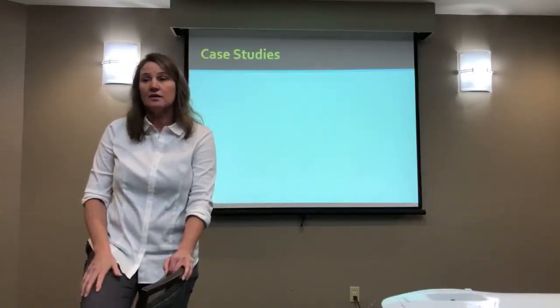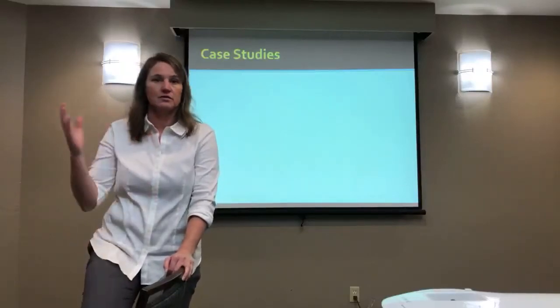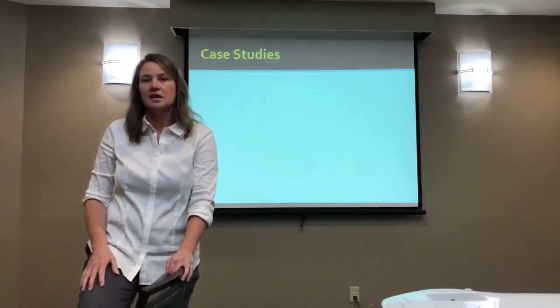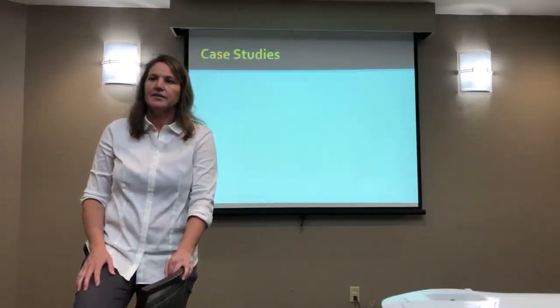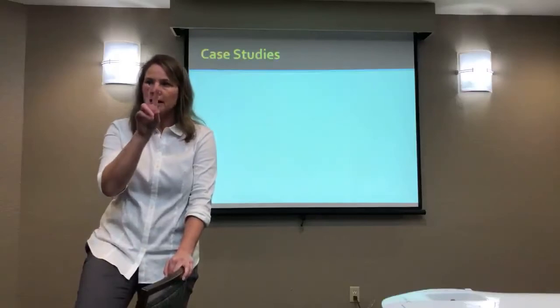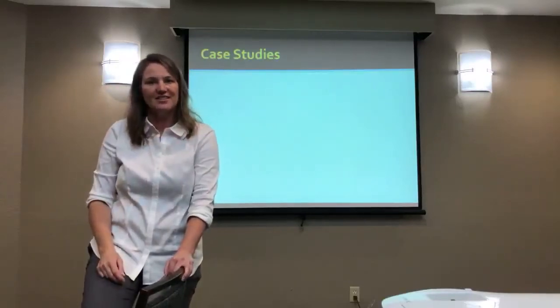I agree. Try that, to get a good feeling. It's repeatable. I mean, it's like our controlled studies that we use, the Berg and the functional gait assessment. All those tests: inter-rater reliability, repeatability. Can you do a treatment, and is it comparable to the one you just did from one day to the next?